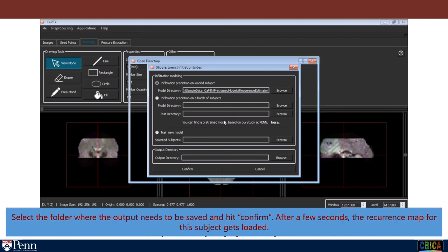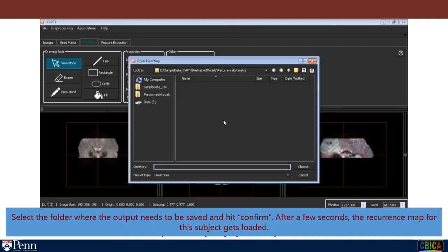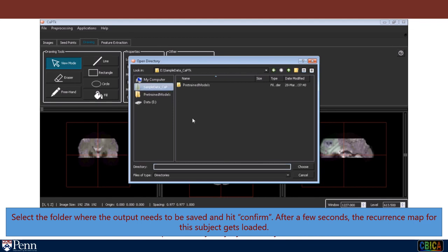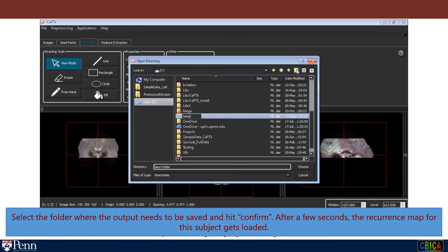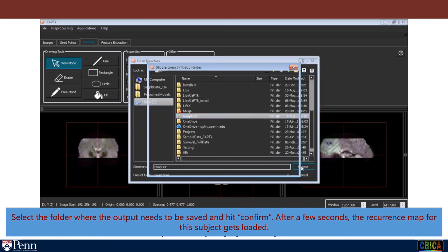Select the folder where the output needs to be saved and hit confirm. After a few seconds, the recurrence map for the subject gets loaded.